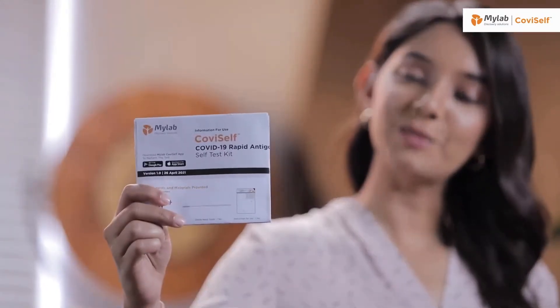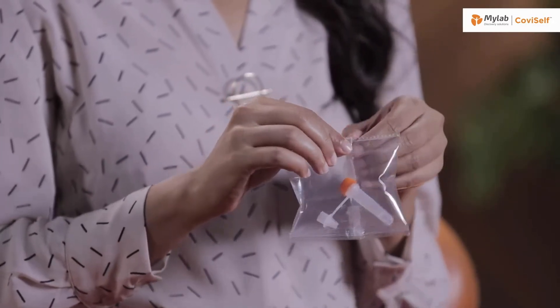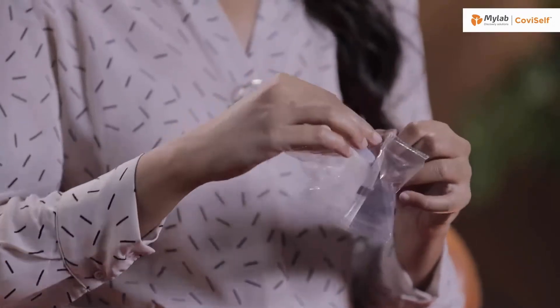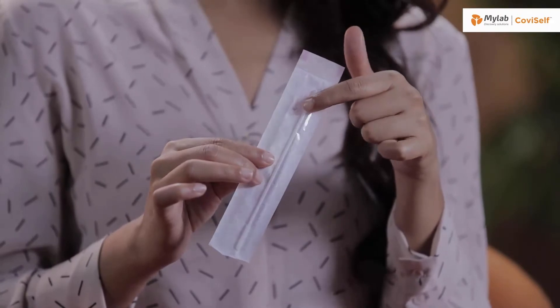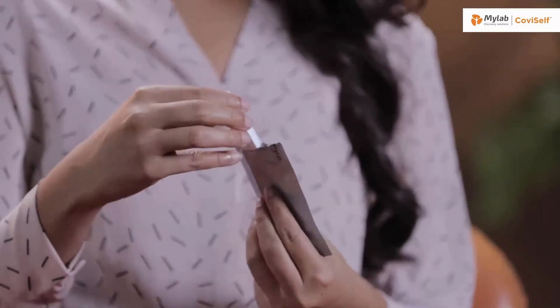This is the instruction manual. This is a pre-filled extraction tube. This is a sterile nasal swab. As you can see, it has two sides — one is the plastic side, and the other one is the paper side. One test card. This is a biohazard bag.